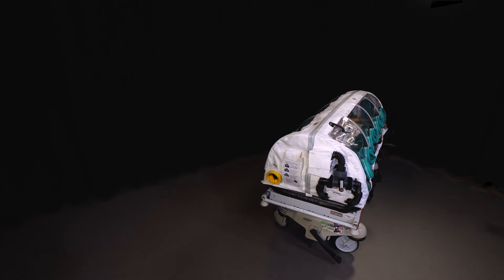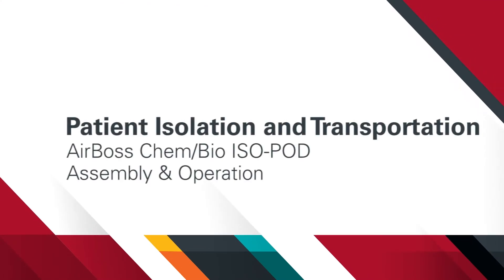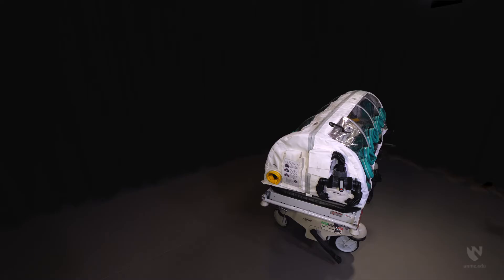In this video we demonstrate the assembly and operation of an AirBos ChemBio isopod. Patient transportation isolation devices are not pieces of equipment we use on a regular basis. Familiarization with the correct assembly and operation techniques of such devices ensures patient and healthcare professional safety when called into use. Other versions of this isolation device are manufactured by this company, and a large proportion of this video is also applicable to those devices.